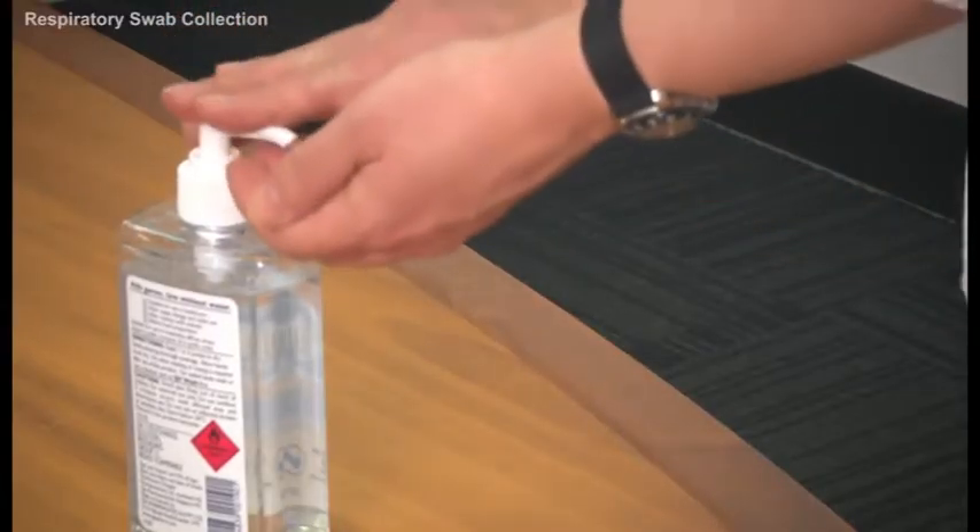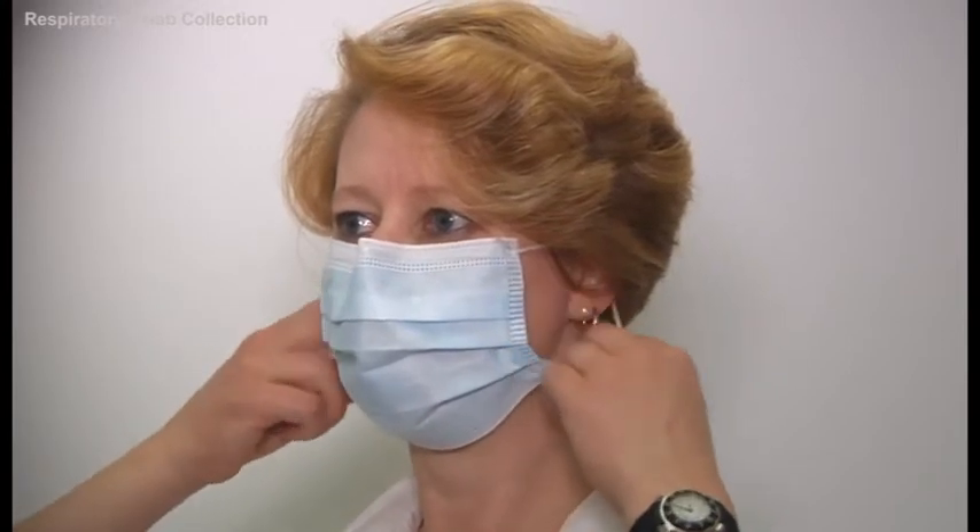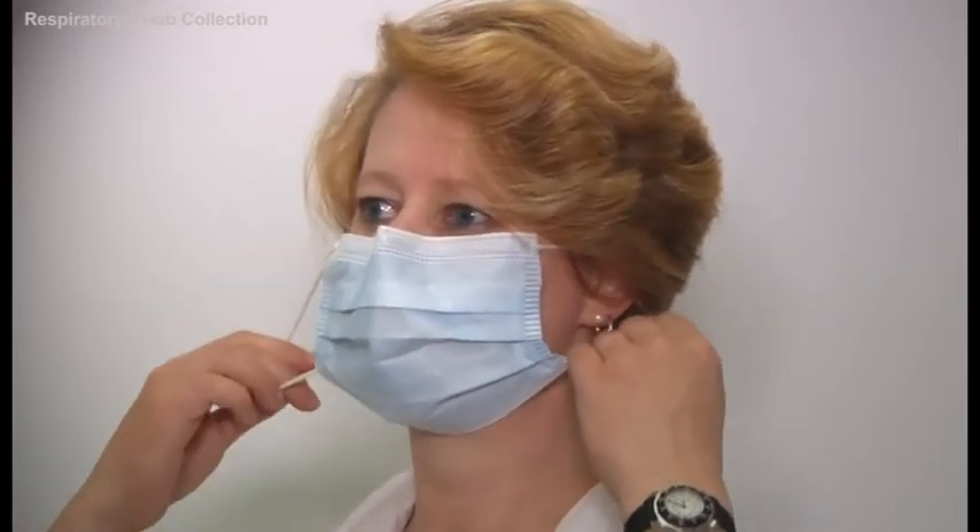Then wash your hands. Finally, remove the mask. With clean hands, remove the mask by pulling it away from the face. Ensure the top and outside of the mask in no way make any contact with your eyes or nostrils.